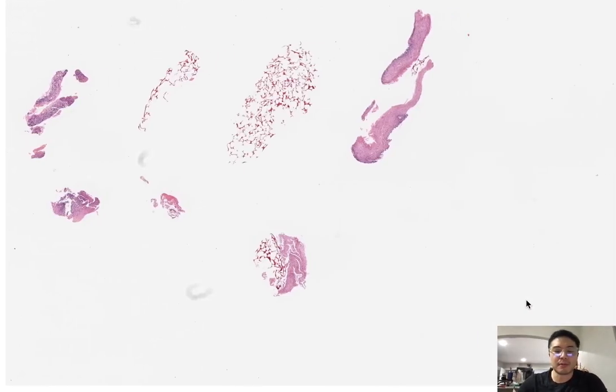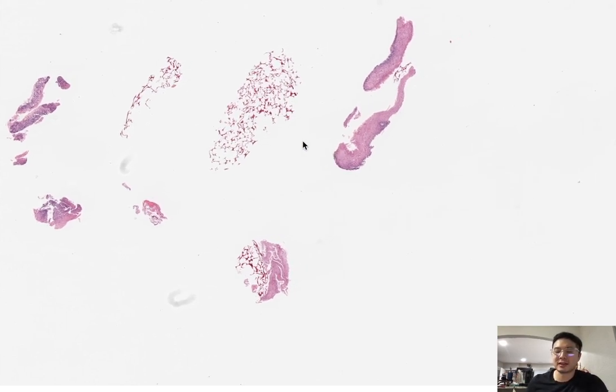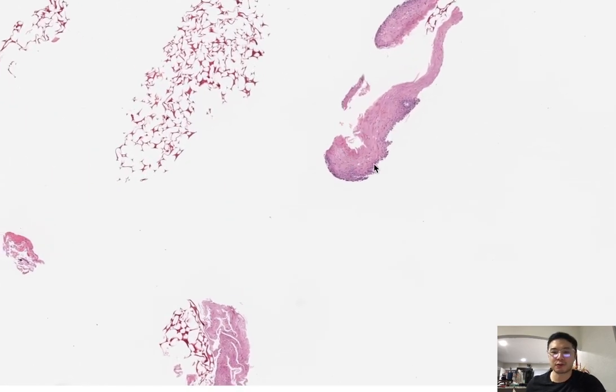Today we're going to talk about the mouth and specifically herpes of the mouth. Usually you don't need a biopsy to diagnose herpes of the mouth. Usually the person will have itching and they'll have vesicles forming around the mouth. But I think knowing what herpes looks like is very important. If we know it in the mouth, then we kind of know it where it presents anywhere because it has pretty specific features. Thank you to Pathpresenter for this case.